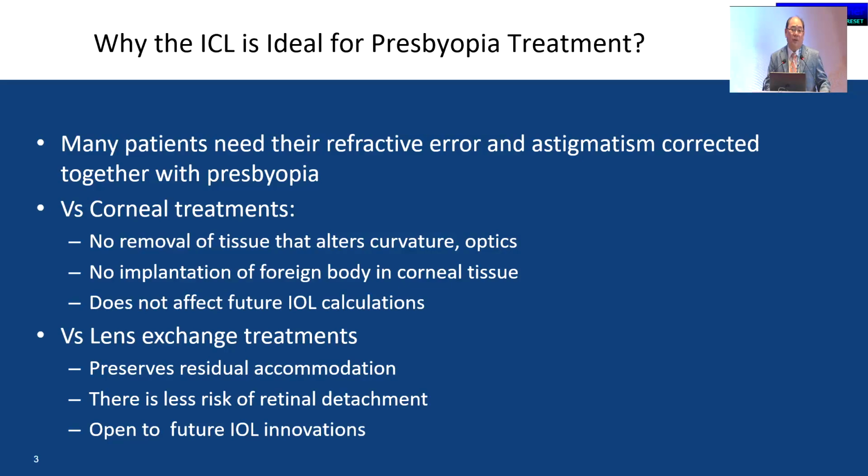I usually don't do clear lens exchange in our clinic. We want to preserve the residual accommodation of the patients, and there's less risk of retinal detachment if you do ICL versus a clear lens exchange, especially on a high myope.